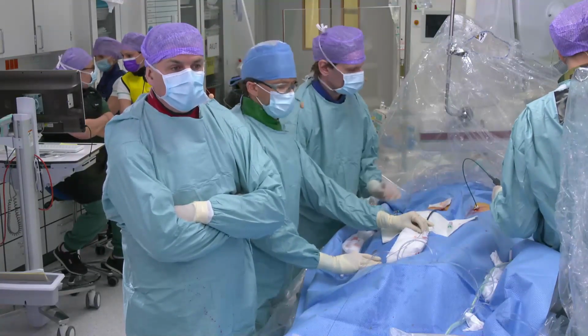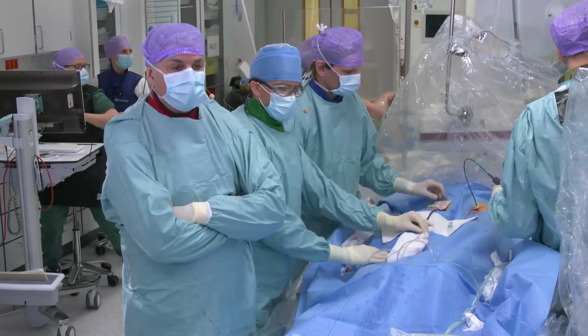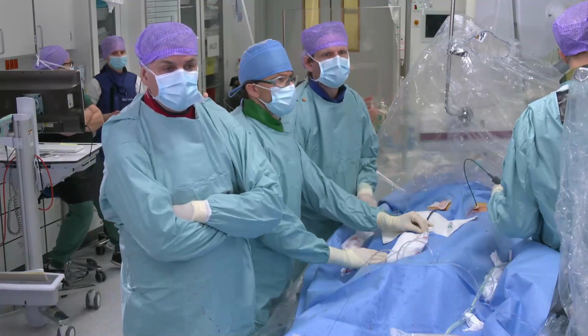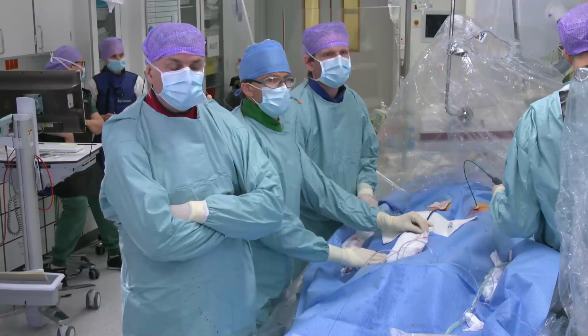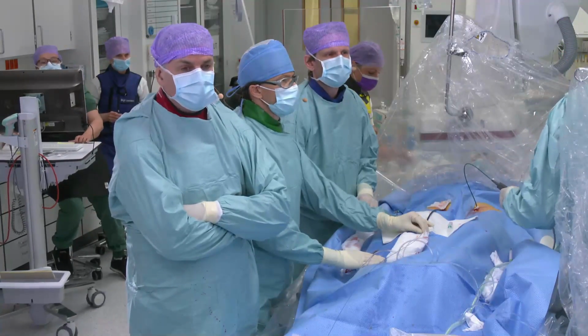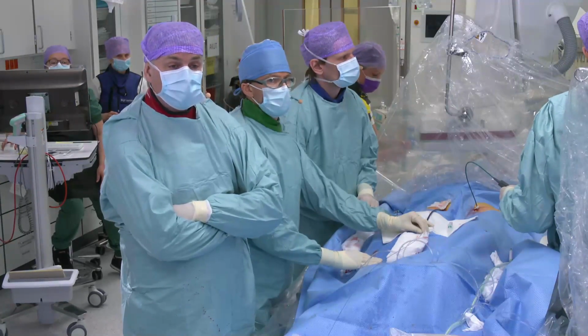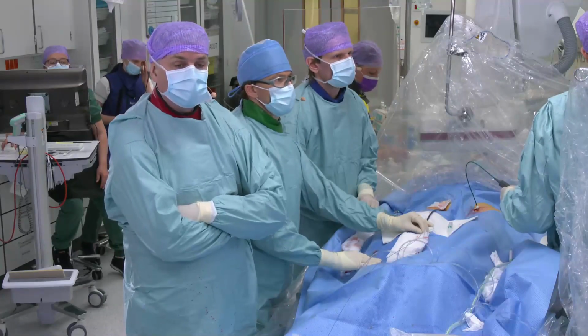But I know it's different from country to country what the tradition is, and I'm sure that skilled operators like Holger can do this on an echocardiography. But I also think that most of these cases around the world are done by operators who are not as skilled, and I think a CT scan for those cases will improve both the safety and the efficacy.